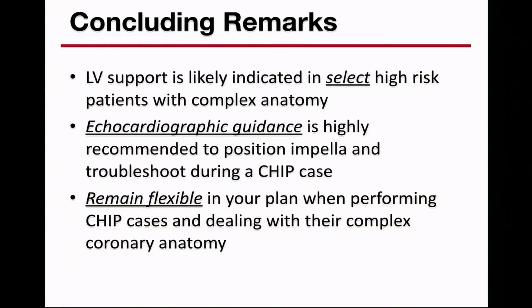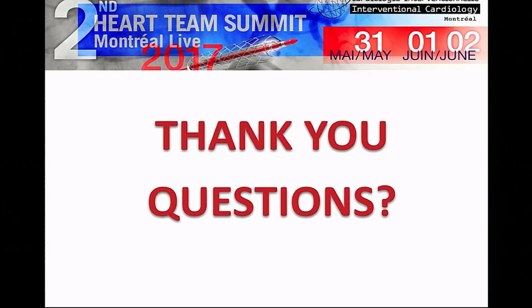So our concluding remarks are that LV support is likely indicated in select high-risk patients with complex anatomy. I think echocardiographic guidance is highly recommended for Impella positioning and troubleshooting during CHIP cases. And when you plan a CHIP case, I really think you need to have an open mind and be flexible about your plan, because you never know how things are going to go and how you might need to modify your plan. Thank you very much.